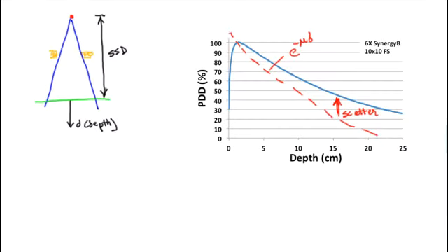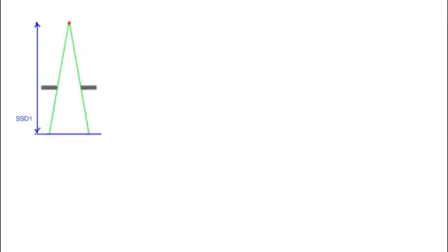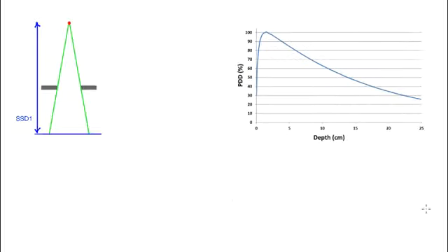So I'm going to have to start by looking at the PDD, and we talked about this a little bit back in video 10.2, but if you'll allow me to redraw this here, I'd like to discuss it in more detail. Here's the PDD for this particular setup. This allows me to find the value at any depth D. I go over here, say it's 10 cm, I can look it up and find what the percent depth dose is there. In the special case where I'm at D max, the PDD is 100% by definition. So that's down here at D max, DM.